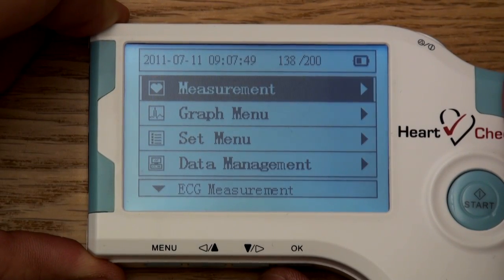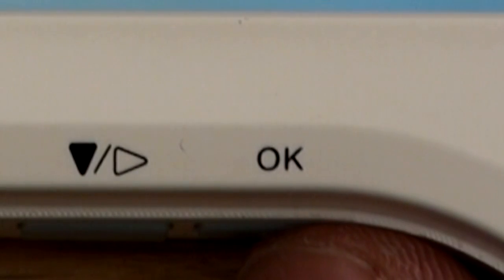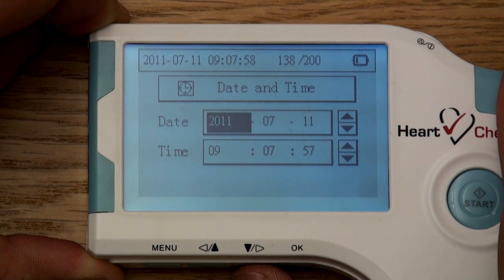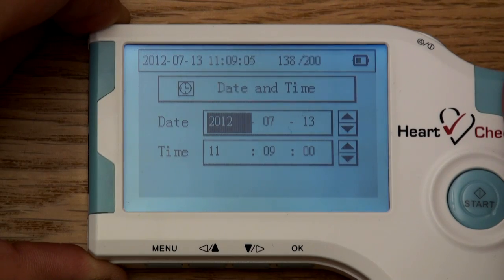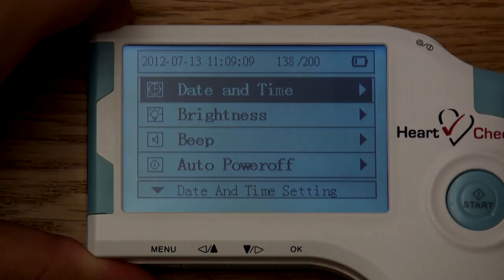To set the date and time, use the arrow buttons to scroll to the set menu category. Once the set menu is highlighted, press the OK button located at the bottom right of the device to select the highlighted category. Once in the set menu screen, highlight and select date and time. You can change the date and time using the arrow buttons. Press the OK button to set the highlighted date and time and move to the next column. Once finished, press the menu button at the bottom left to return to the previous screen.